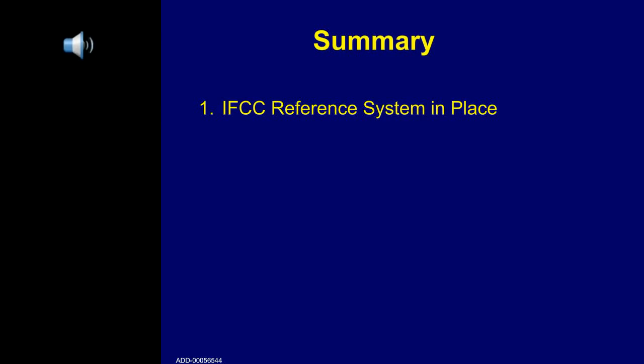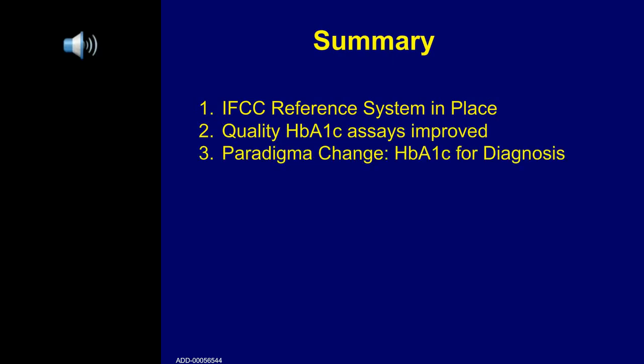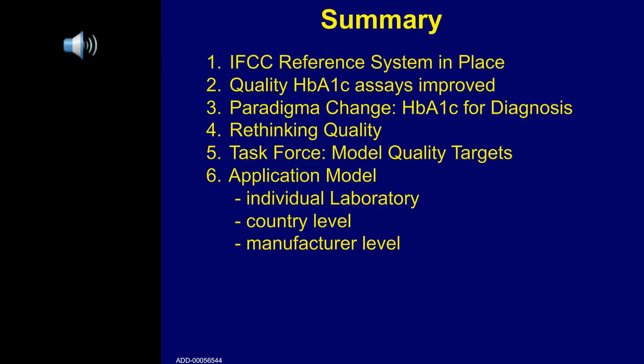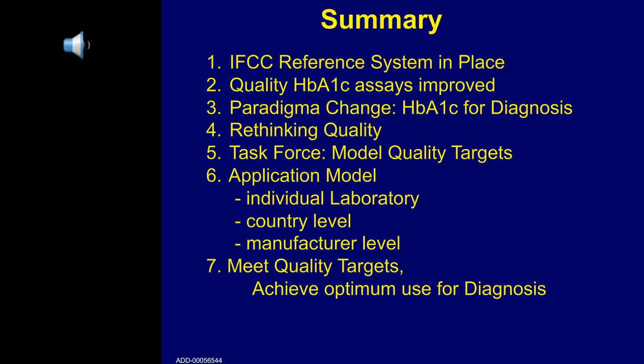To summarize, the IFCC reference system is in place and used. Second, quality of HbA1c assays improved dramatically, and that led to a paradigm change. HbA1c is now also used for diagnosis. That led to rethinking of quality, and the task force constructed a model for quality targets that can be applied in the individual laboratory, at a country level, and at a manufacturer level. And once quality targets are met, we do what we have to do. We have achieved optimum quality, and that's optimum for use for diagnosis.